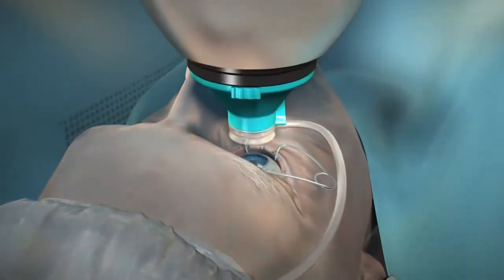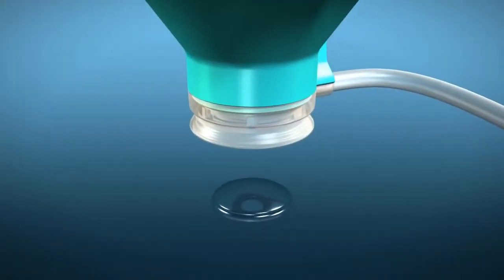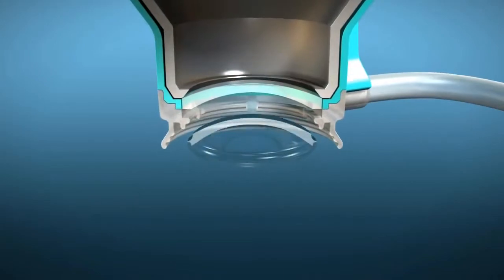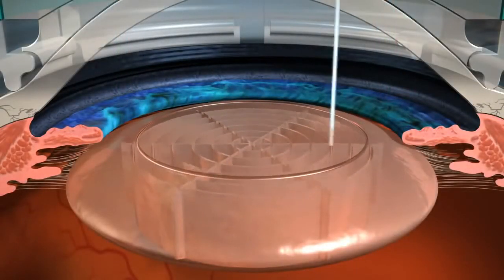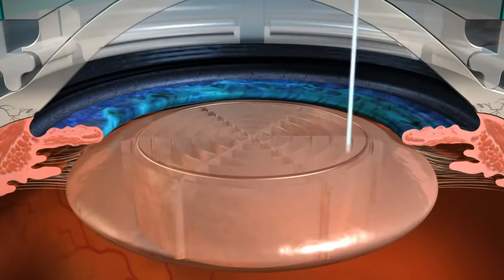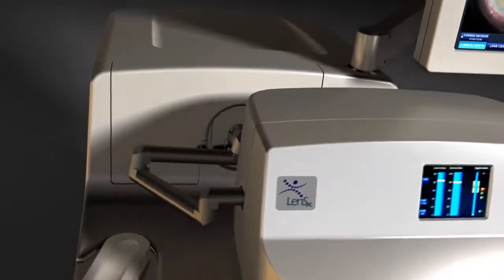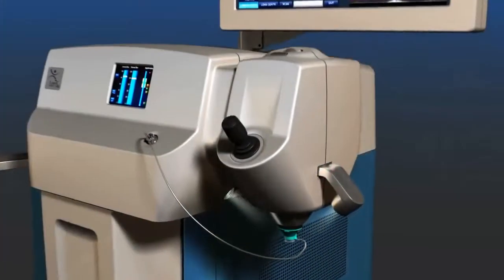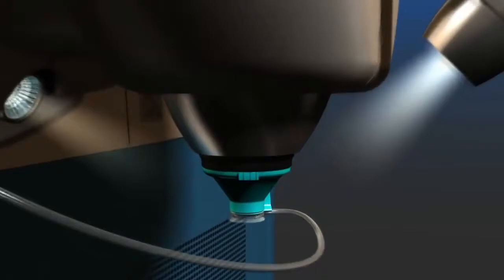With recent technology advancements in cataract surgery, surgeons now have options that allow patients to make informed decisions on how their cataracts will be removed. One such advancement has been the introduction of laser refractive cataract surgery with the LensX laser. The LensX laser is designed to bring a new level of accuracy and reproducibility to refractive cataract surgery.